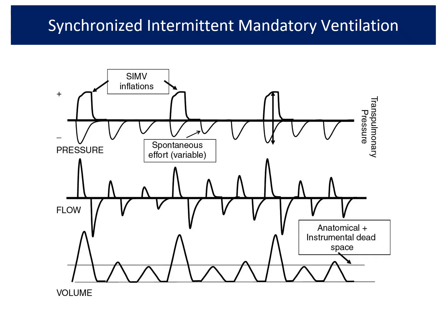Whenever the patient's effort and the mandatory ventilation come together, both these volumes will be summed. So basically, you'll get three different types of volumes: 400 ml when the ventilator is giving mandatory breaths, 200 ml when the patient is having spontaneous effort, and 600 ml when the patient's breath is getting synchronized with the ventilator breath.